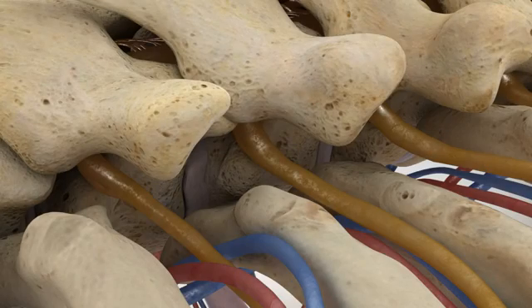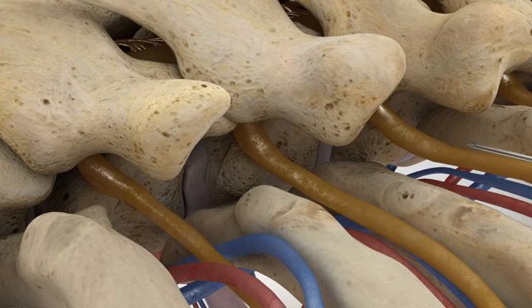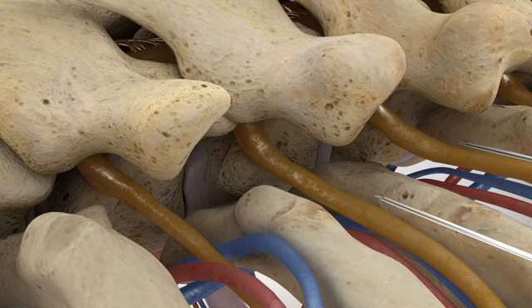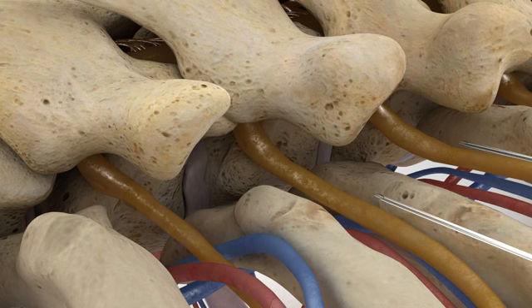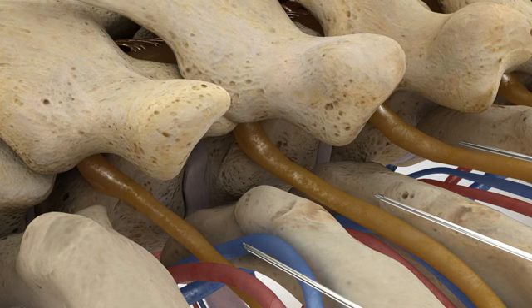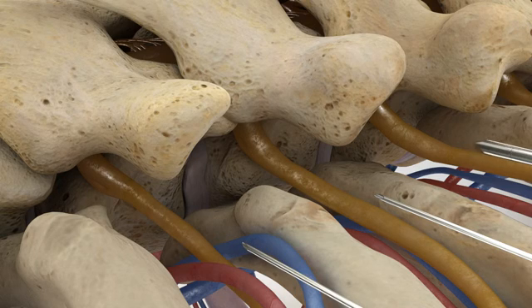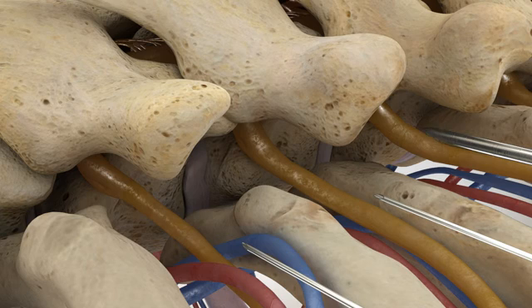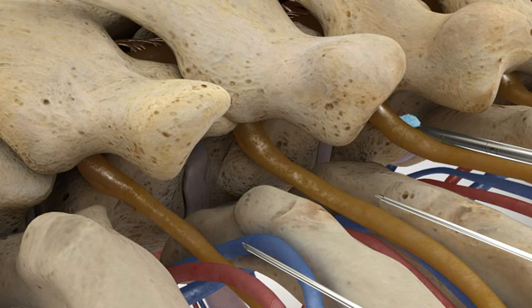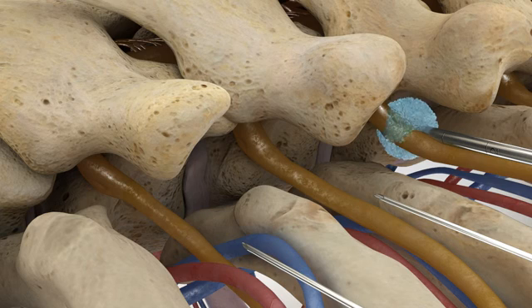Twenty-five gauge needles are inserted to confirm the angle and allow for injection of lidocaine or other local anesthetics. The ideal angle is parallel to the transverse process and allows for positioning cryoprobes in between the transverse process and the inferior aspect of the corresponding rib.